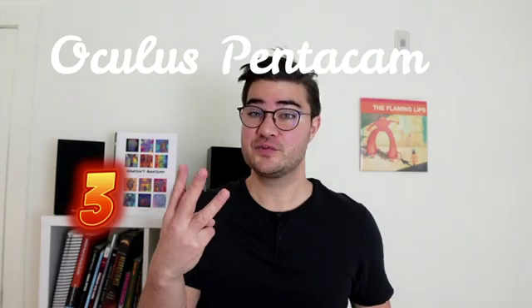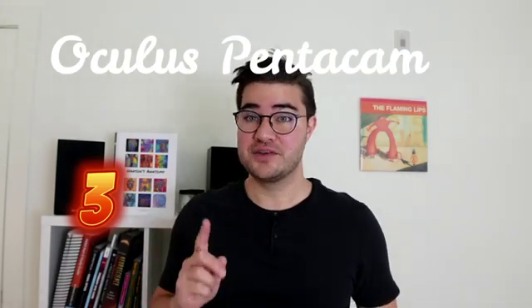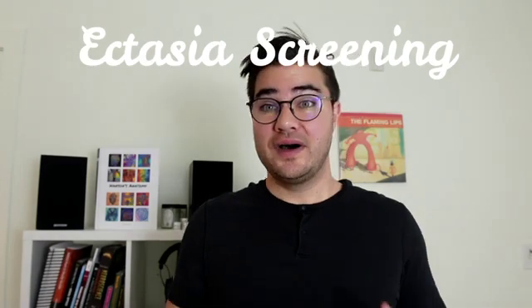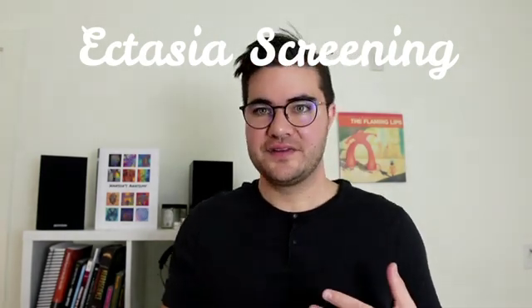Alright. It's been about 20 years since the Oculus Pentacam first hit the market. Here are 3 reasons why I love the Pentacam and why it's the one piece of diagnostic equipment that just won't go away. Number 1. Ectasia screening. Unlike other commercially available scans of the cornea, the Pentacam is a tomographer rather than a topographer.